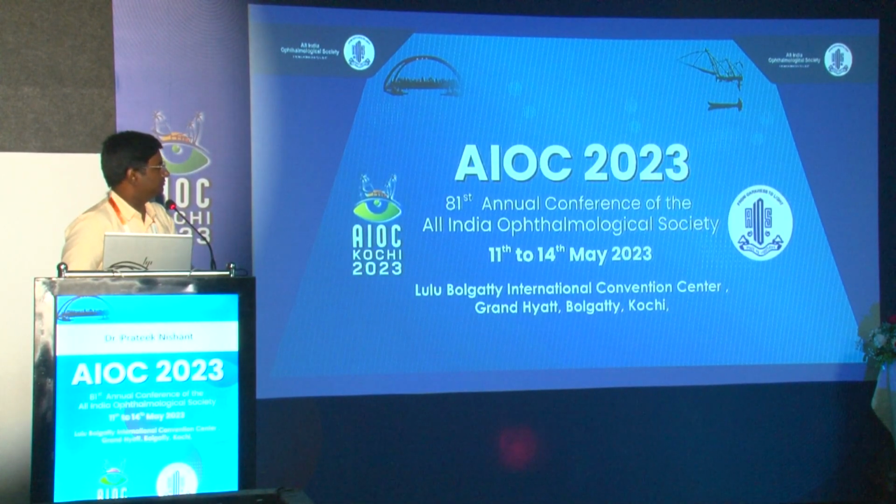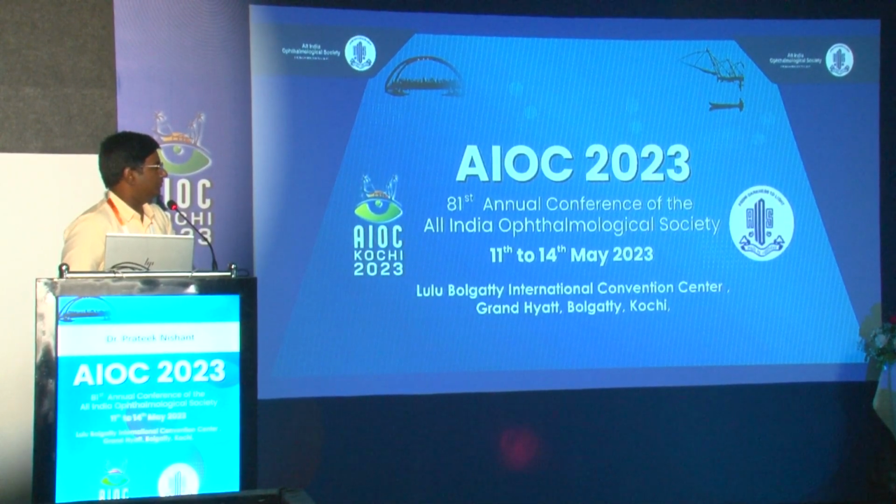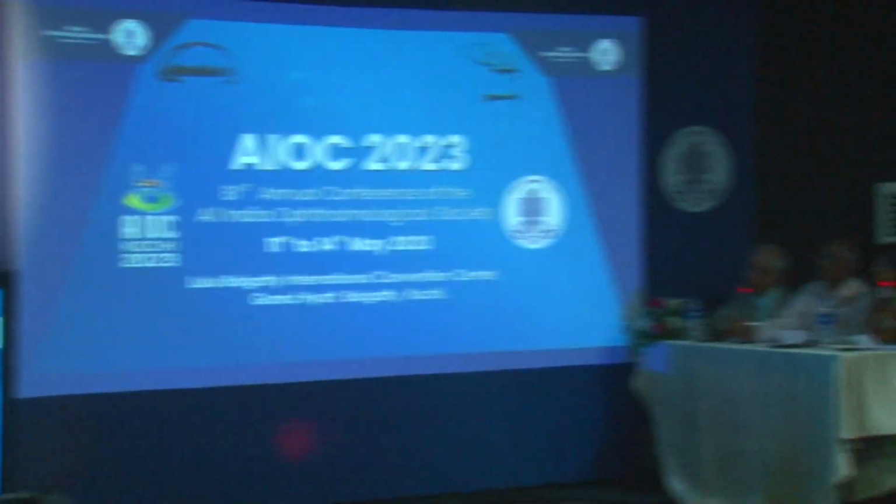Okay. So you said this is the first study for a 2.2, but there are already other studies which have compared with a 2.25 incision, a single incision on the steep meridian. Exactly, so sir, what was that? You put both the incisions on the steep meridian, or one temporal and another on the steep meridian? Both incisions on the steep meridian, diametrically opposite.